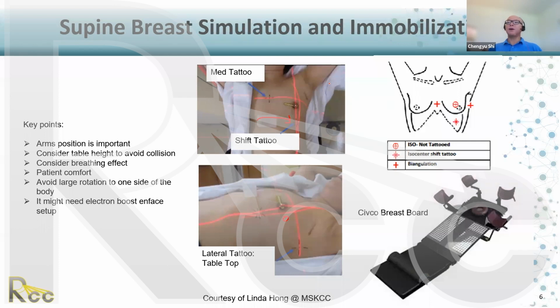And during treatment you can monitor the patient motion, and it's also good enough. So the two sites popularly used for SGRT at Memorial Sloan Kettering Cancer Center at least are the brain and the breast. We use it a lot. Gotcha. Thank you so much.